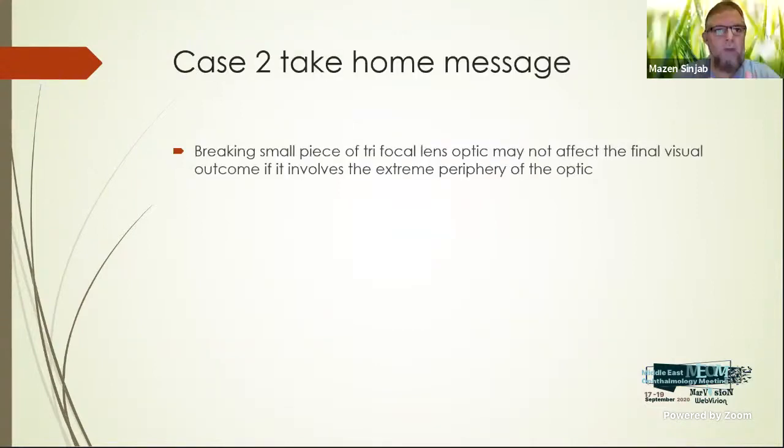So may I have a question, Dr. Yahya? Yes. Dr. Omar said that we will keep the cut edge laterally while you kept it nasally. Which one is better? Regardless of the orientation, let's suppose that this is not a toric lens. So which one is better? The visual field is narrower from the nasal side compared to the lateral side. So I think if we keep it nasally, it's better, because the visual field is narrower nasally.